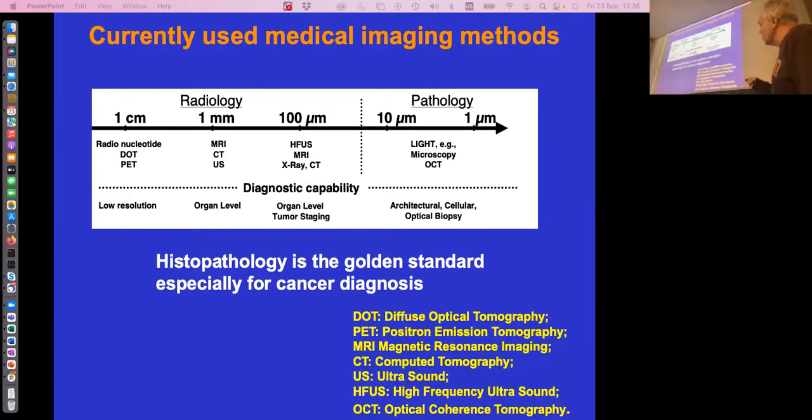And the pathologist not only looks at, let's say, the cells in the tissue or the intercellular structure. Intercellular structure is important. For instance, in cancer, the nuclei are not spherical anymore. They become elongated. That's part of the division process. But he also looks at the macroscopic picture, which means on a larger scale of millimeters, what is the structure of the tissue? Do I see disruption of the normal layered structures that I expect? I will show images of lung and of the retina, and what you will see is always very nicely organized layered structures. That's in general how your epithelium works.